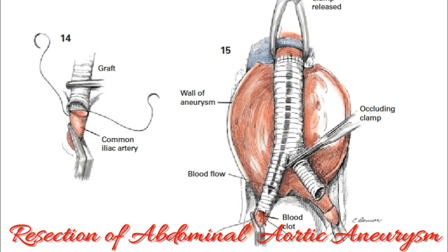Vascular clamps are temporarily applied to the iliac limbs of the graft, and the aortic clamp is momentarily released to check the proximal suture line for hemostasis and pre-clotting of the graft. Should leaks be noted in the anastomosis, they can be controlled by individual mattress sutures. The iliac anastomoses are done in the same manner as that of the aorta. Just before completion of the anastomosis, the aortic clamp is opened momentarily to flush any clots that may have accumulated in the aorta or graft. This flushing greatly lessens the incidence of subsequent thrombosis in either extremity.